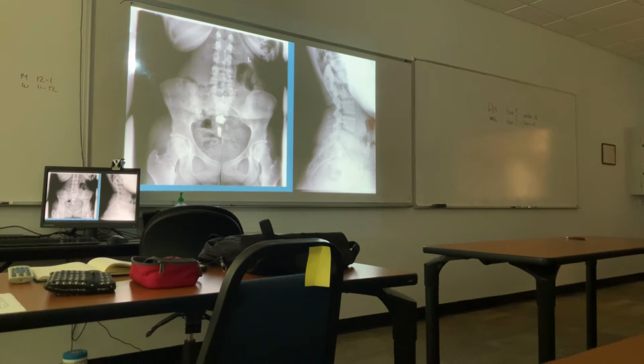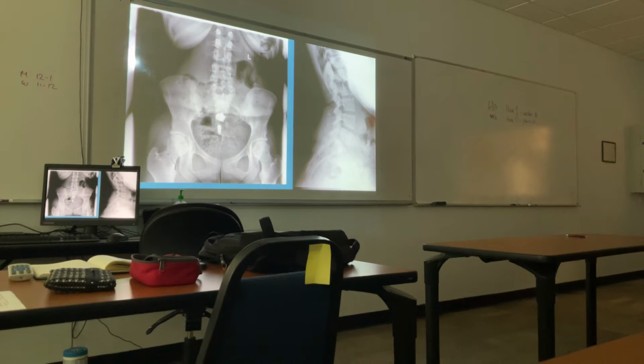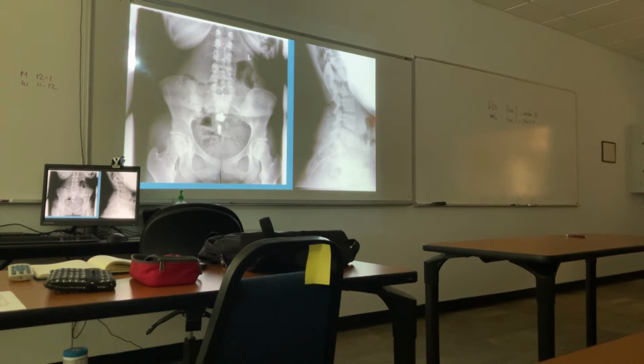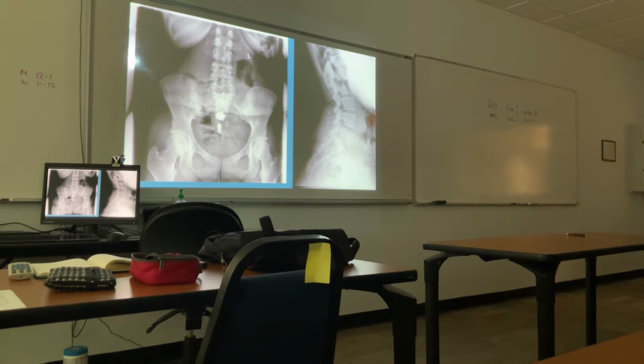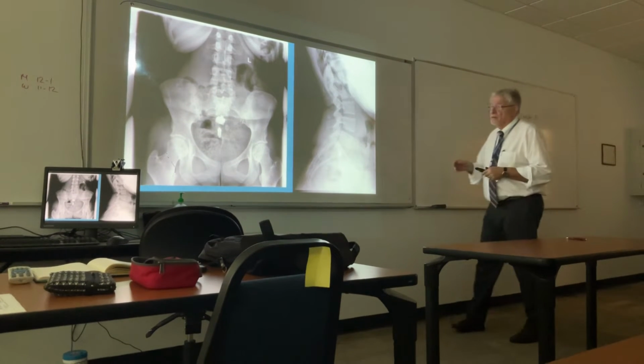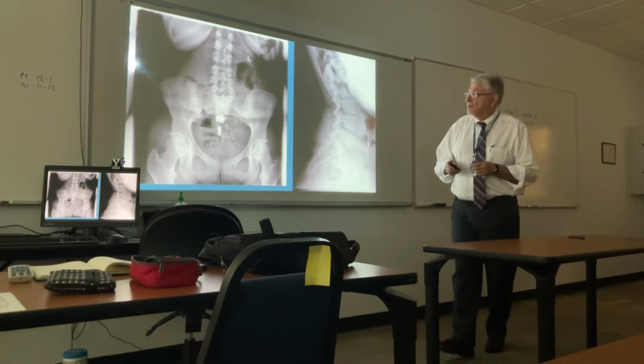L5. No, L5 is fine. 4, 3, 2. Is there radiolucency there? Yes. Okay, teaching point is complete your search pattern, okay? So what's wrong with L5? I didn't even have that part of the image on my screen, I hadn't scrolled up.